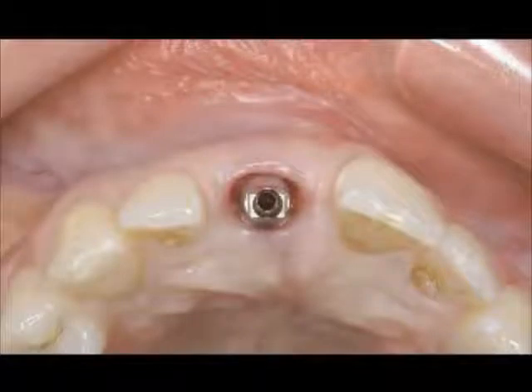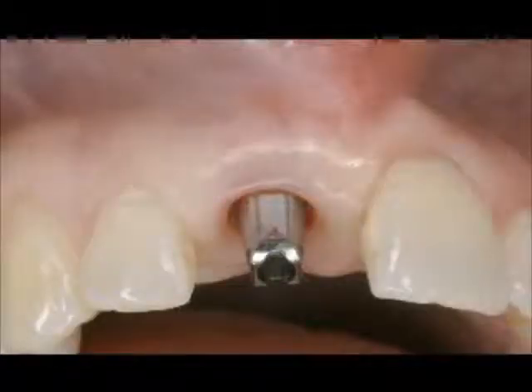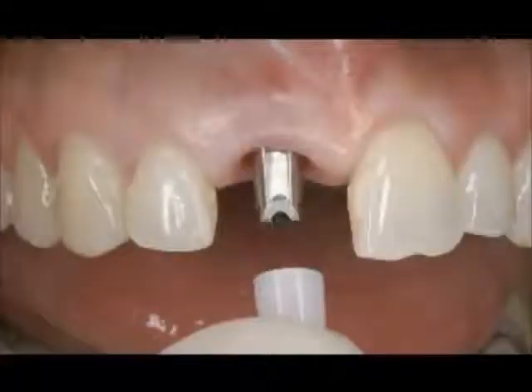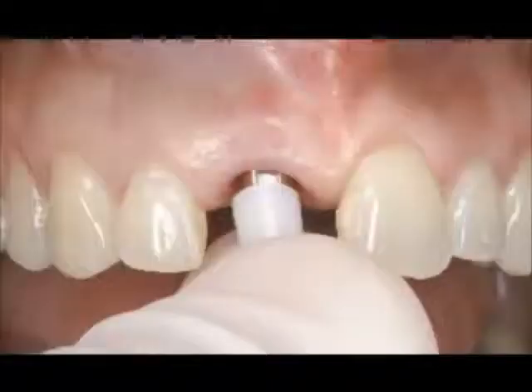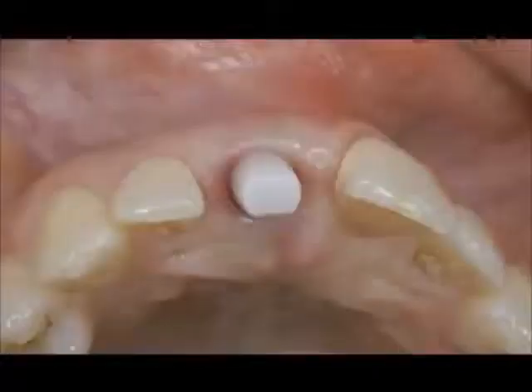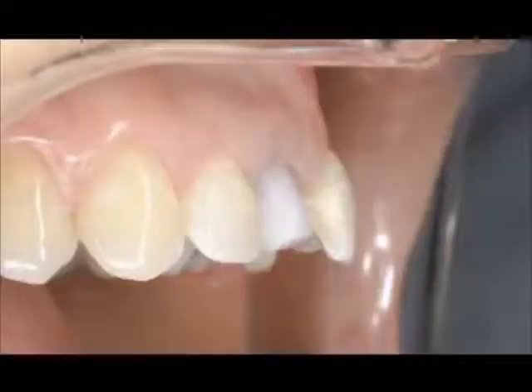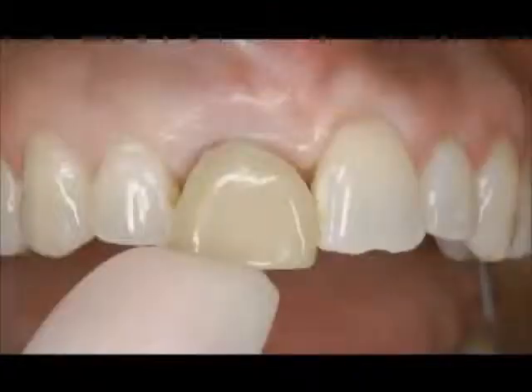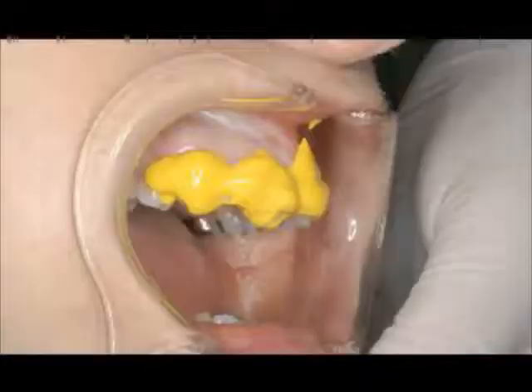You can see that it has a snap cap and undercuts on the coronal aspect, and we can utilize a temporary cap to pick up the margins once we fabricate our temporary restoration. This can be done in the mouth, or it can be done on the previously made laboratory model. Remember, we did that at the first surgery. So this really expedites things very nicely.